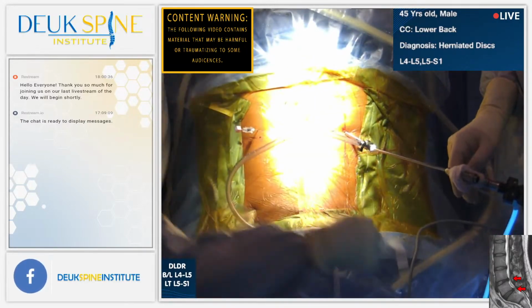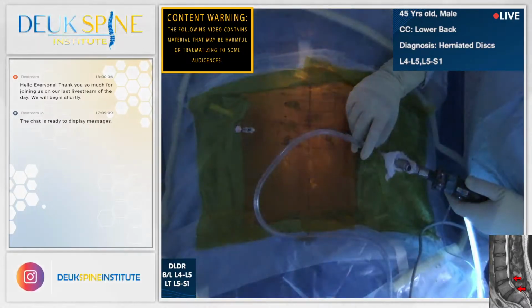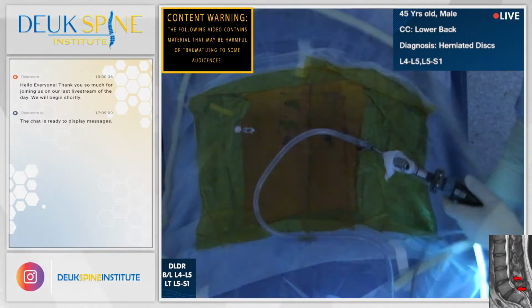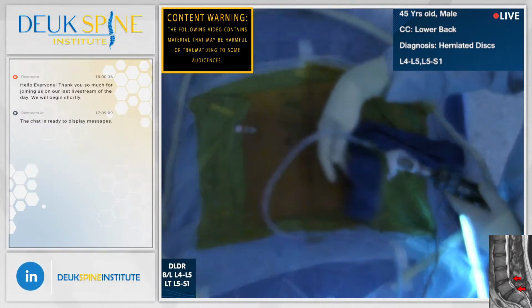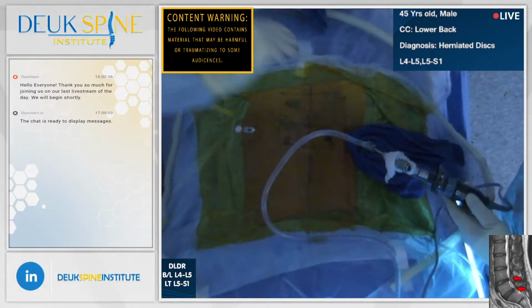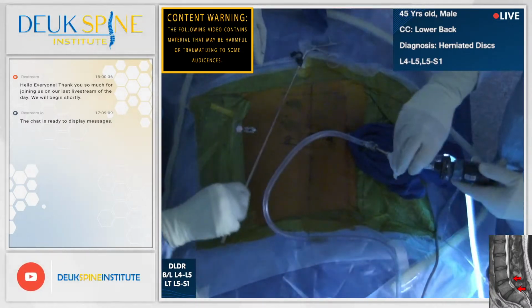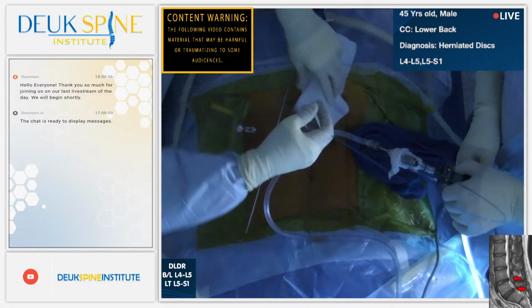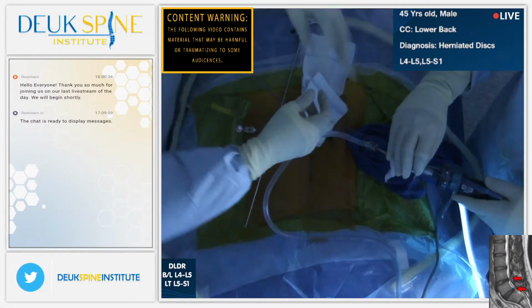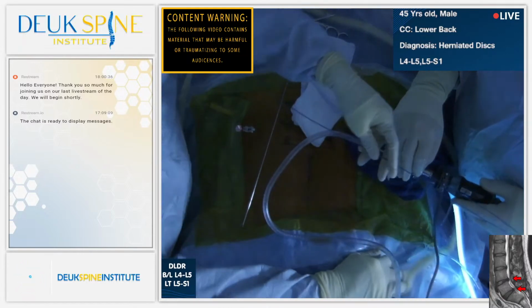Scope on. Okay, laser, blue towel. I got it. Nice. I don't know if we're broadcasting. I'm just operating. Either way, broadcasting or not, I still have to operate.